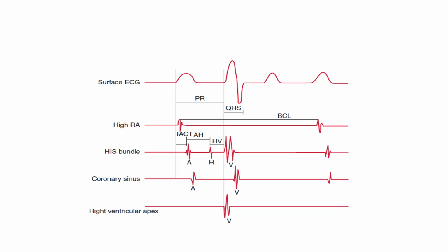So you just take your ECG, let's say you get an RR interval of 4 boxes. How many milliseconds would that be? 800 milliseconds, right? 0.8 seconds or 800 milliseconds. So divide 60,000 by 800 milliseconds. What will you get?